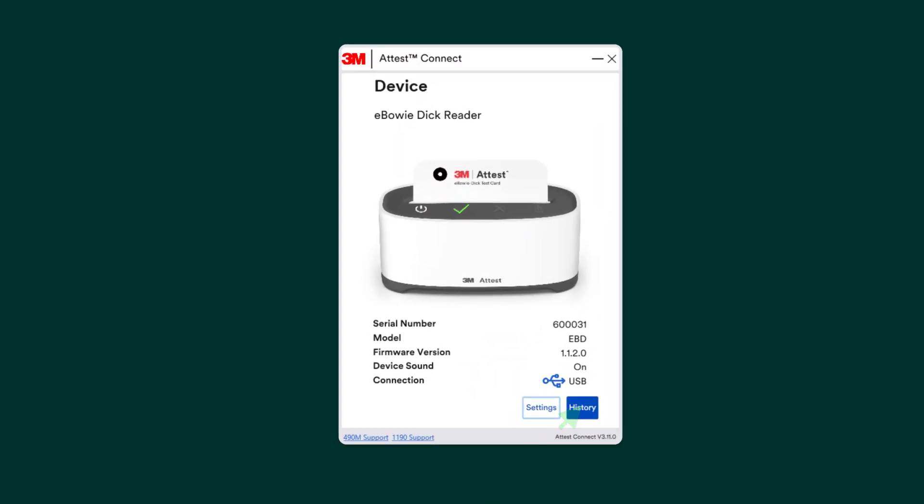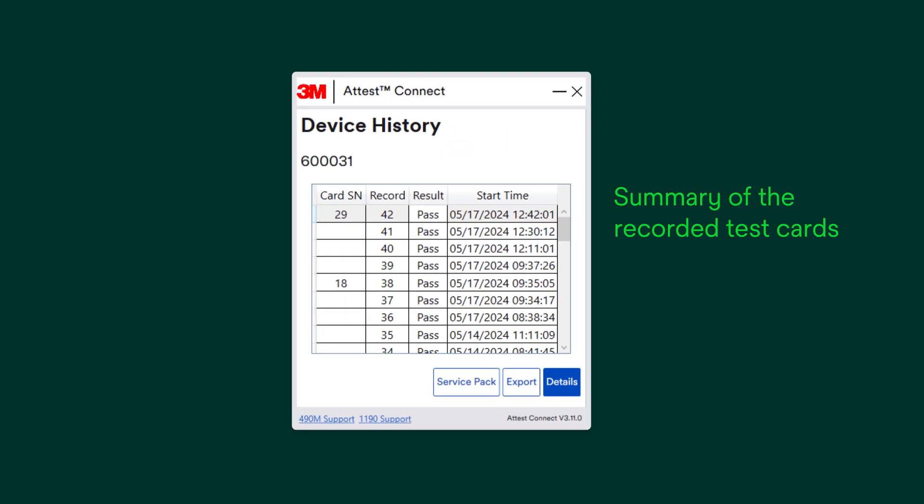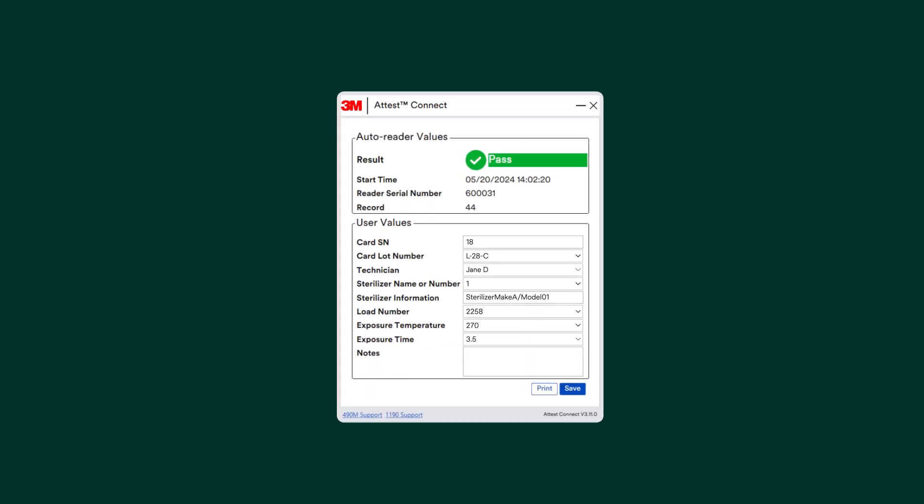By clicking on the History button, you can double-click on the individual test card results to open the Details page. In the Details page, you can review or add further detail.